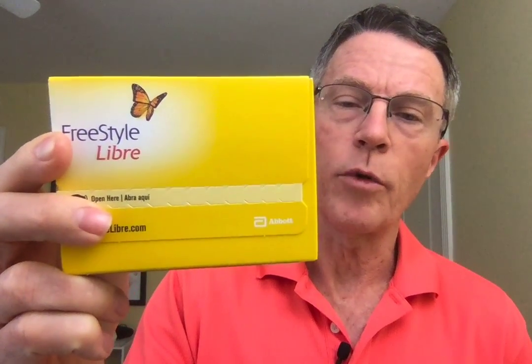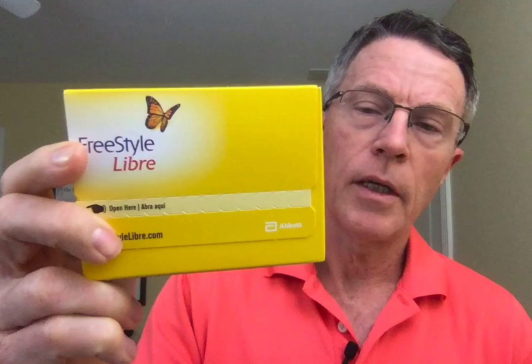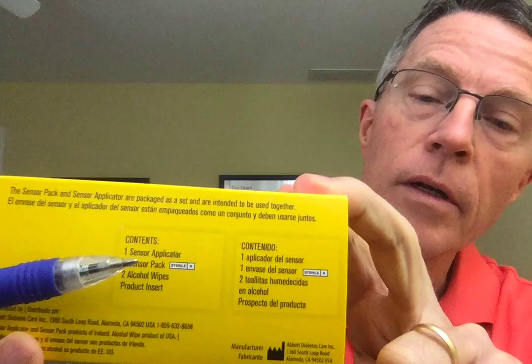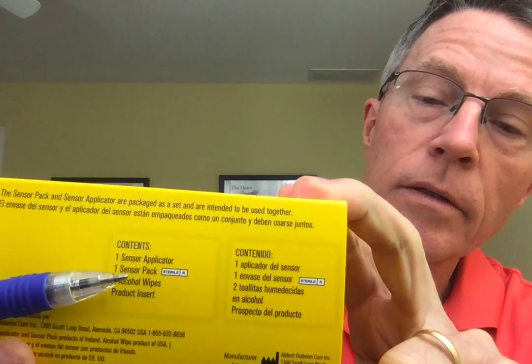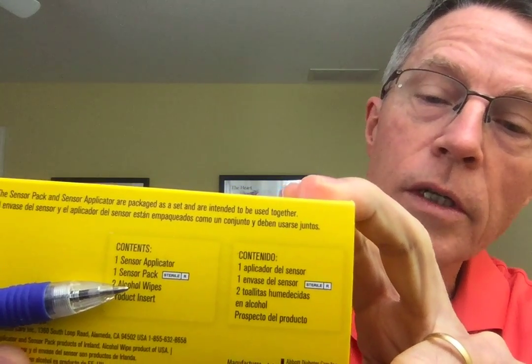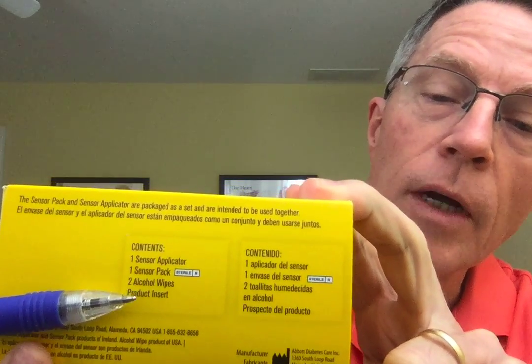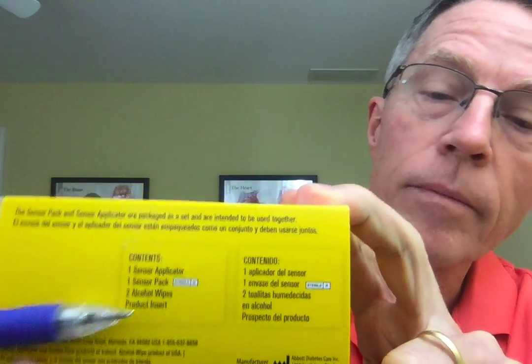Today's going to be an unboxing video for the Freestyle Libre. It just came out fairly recently and my pharmacist didn't know how to order it — it took him a couple of days to figure it out. The contents are a sensor applicator, the sensor, one sensor packet, two alcohol wipes, and a product insert.